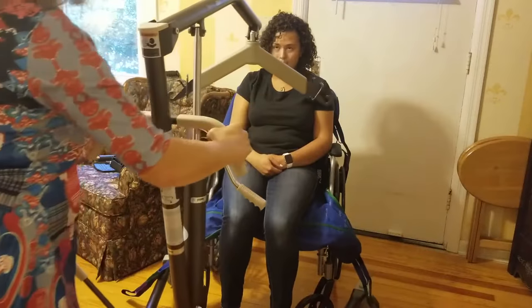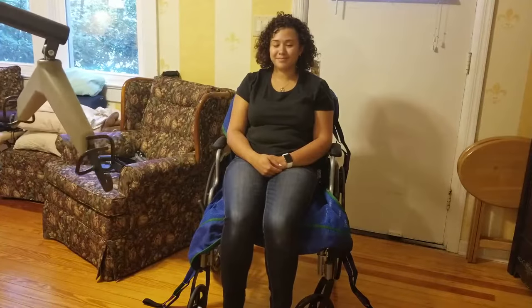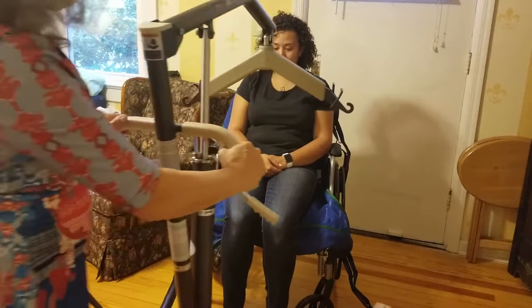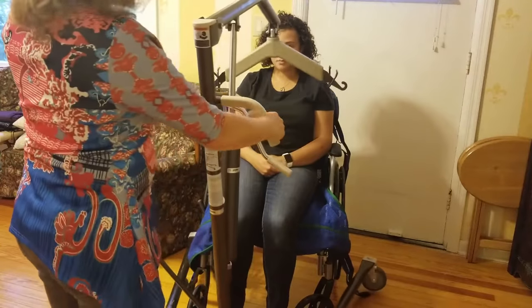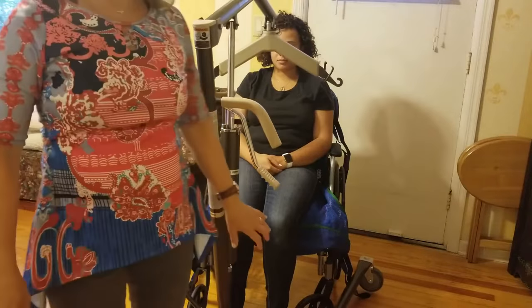Take the Hoyer lift away once finished. Make sure the patient is nice and secure in the chair. When you're ready for them to go back to bed, bring the Hoyer lift back, put the loops on, crank it up, and reverse — going right back into bed.